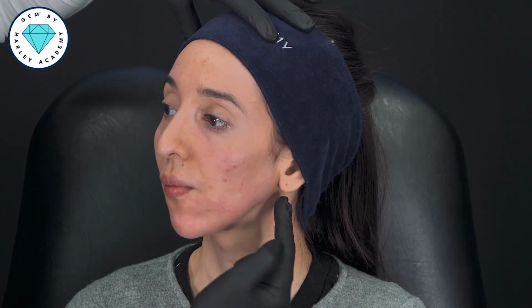And I hope you can appreciate the beautiful projection here, the very smooth transitions from the eyelid to the cheek and the support to the temples and the tails of the brow. We then treated the piriform fossa with a needle. Okay, that's a stage 1 and stage 2 technique. And then moving into the lower face, gonial angle and connecting it through to the jawline. I think this has been really quite striking in terms of the bigonial width. The width of the jawline and the width of the cheekbones are now correlated to create this really beautiful feminine lower face, all the way through to a final treatment of treating in the subdermal plane in the chin, not to create more shape and structure, but more to soften the muscle activity and to really help with this continuous, beautiful jawline all the way through to the chin.